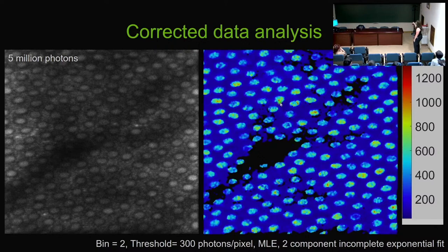And you can also see, though, very clear separation. These are much sharper. The appearance of the cones looks much sharper than it even did in some of our other images. Very clear delineation there. So we're really pleased with this software.